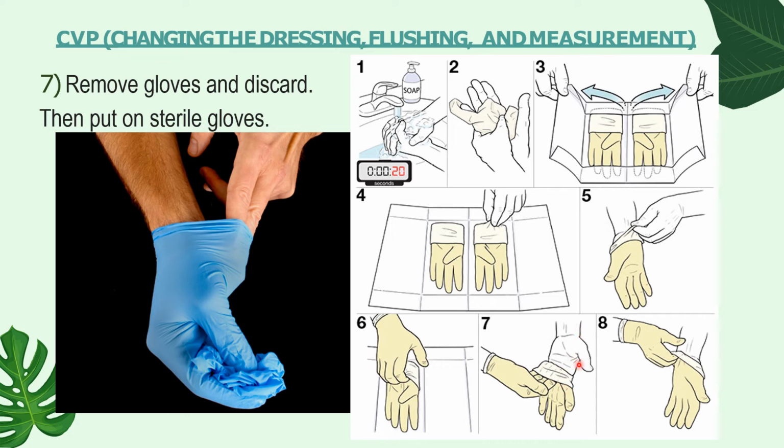You can insert your ungloved hand here, and then while your gloved hand is still handling the sterile part of the cuff. This part, the uncolored part, will touch the skin of the client. So you have to be very careful. As you can see in this picture, actually in real setting, the thumb should not touch the skin.